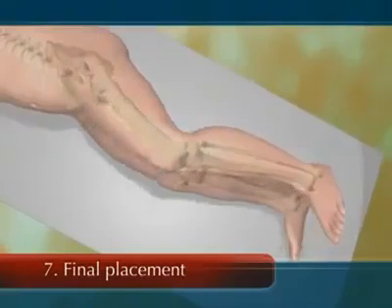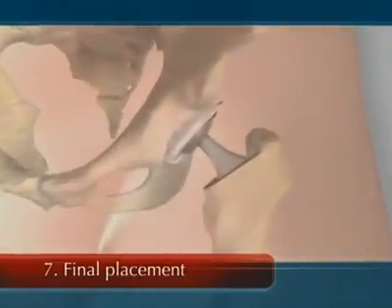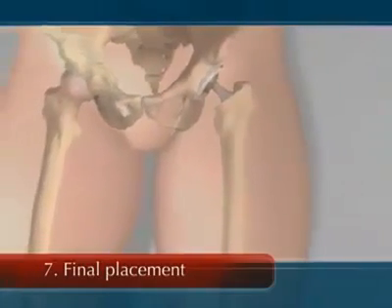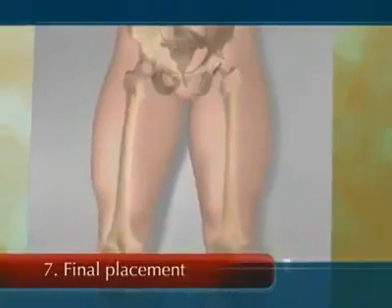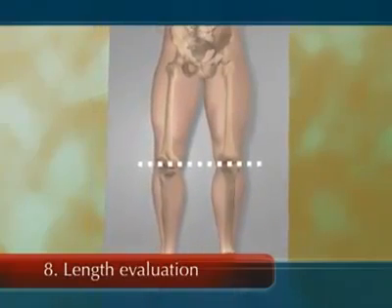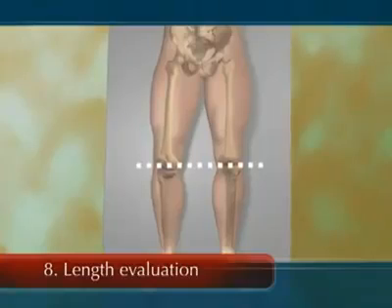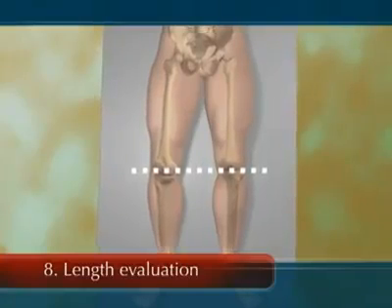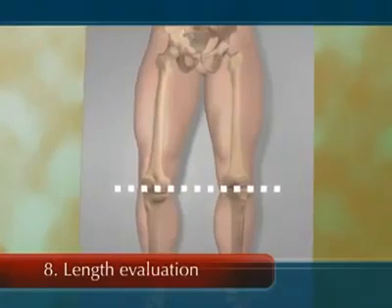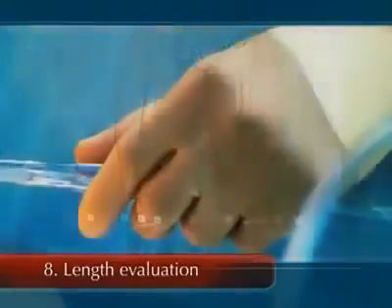Once the appropriate combination has been found, the ball is then placed onto the femoral stem, and the final insert is placed into the cup. The leg is evaluated again for stability and mobility and leg length equality. Throughout the operation, numerous measurements and operative considerations are taken to equalize leg lengths. However, the primary goal is to achieve a stable, non-dislocating hip. Prior to final assembly of the total hip, leg lengths are again evaluated. The new implants will replicate your hip joint.